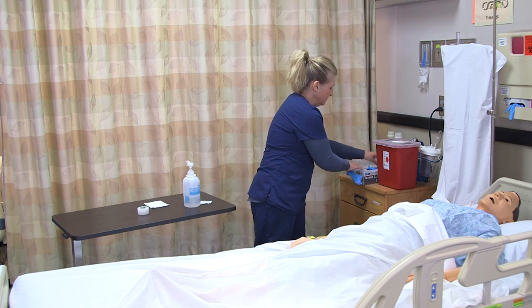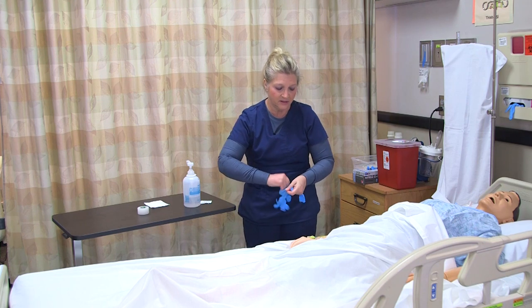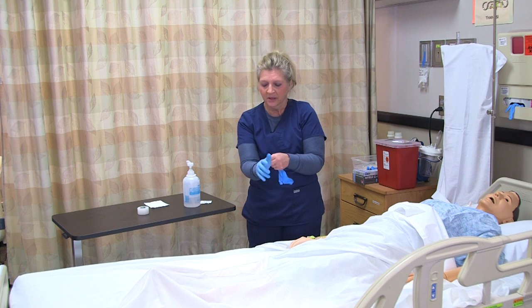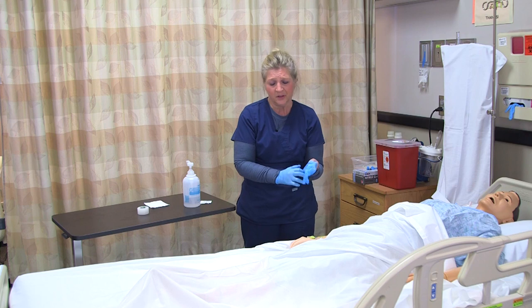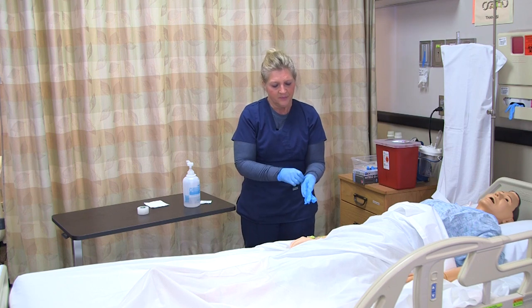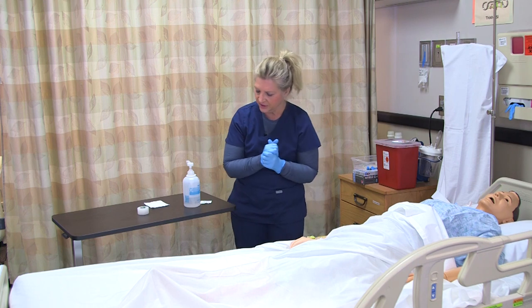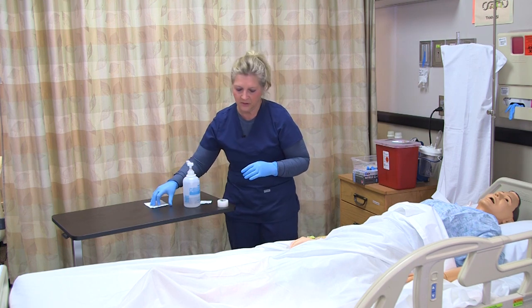If the patient has any bleeding tendencies or is on anticoagulant therapy, the patient may bleed a little bit more. You would want to hold pressure for a longer period of time and check it more frequently, even after you have removed it, just to make sure they're not having any problems with bleeding through.